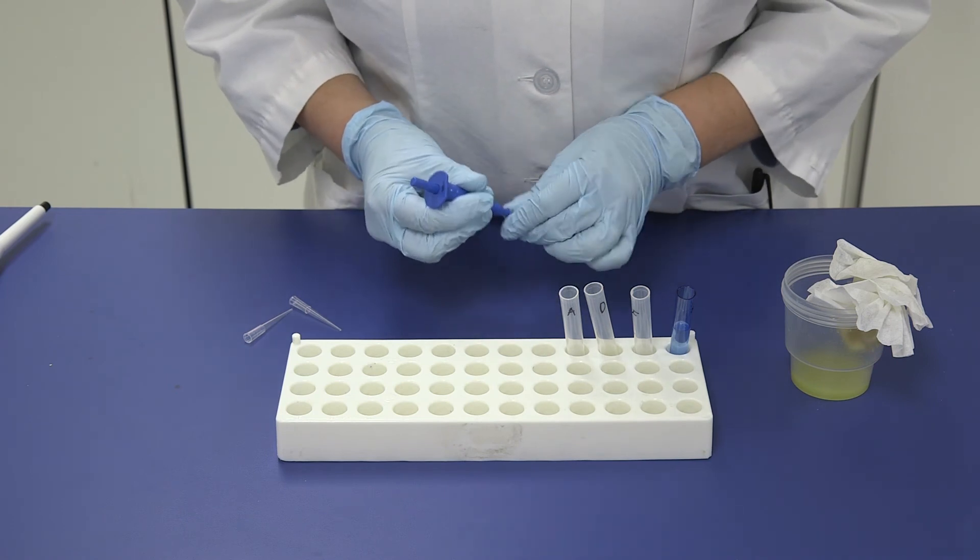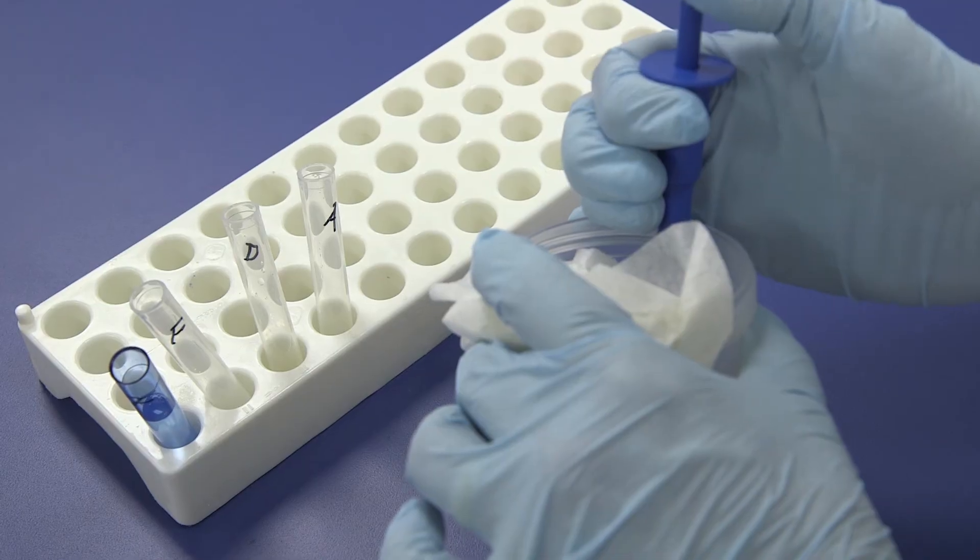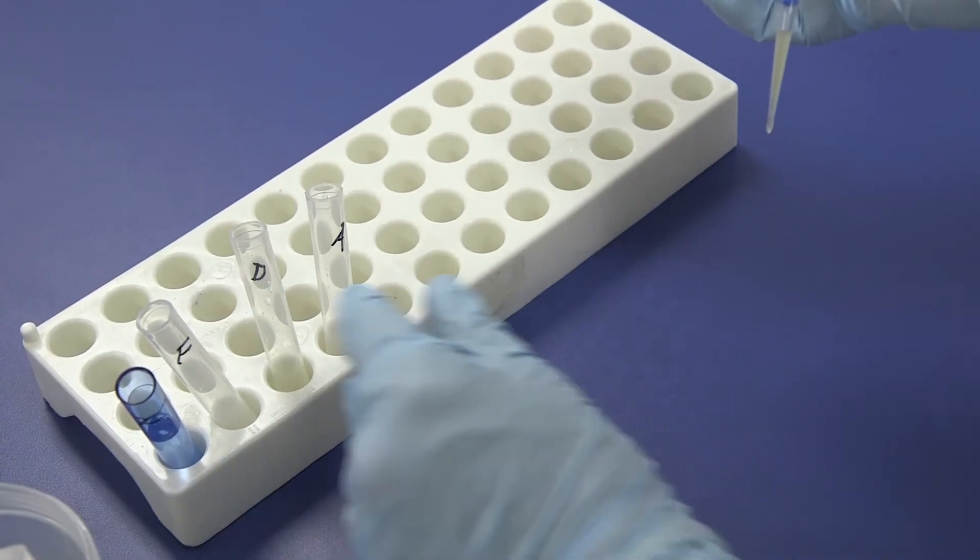Place a clean tip on the 100 microliter pipette, swirl the extract cup, and transfer one pipetteful of the clarified extract to the clear reaction tube labeled A.